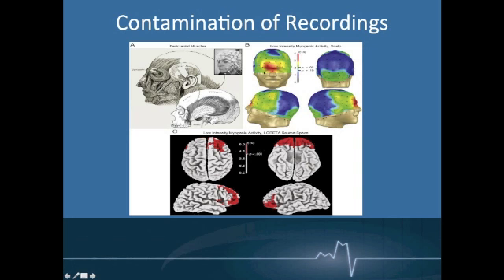Actually, what they're showing, this slide is meant for EEGers that are picking up myogenic activity. So they have the opposite problem. They're trying to record EEG, and they keep picking up muscle tone from the eyes, right? And so this hot zone here is actually myogenic activity. But I think that it was a nice figure, so I showed it. It really serves a purpose. What you're seeing is this fast frontal EEG in those channels. So be aware of that if you ever don't know what it is. Questions so far?